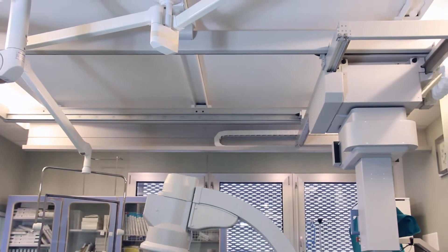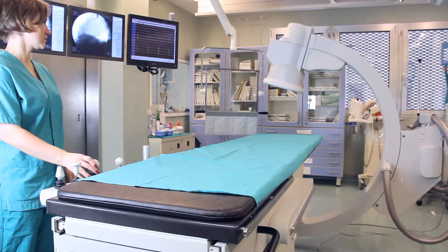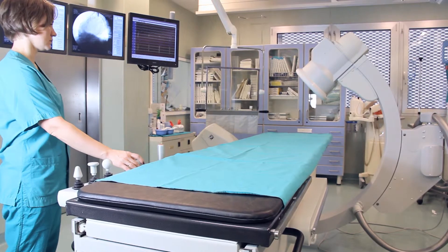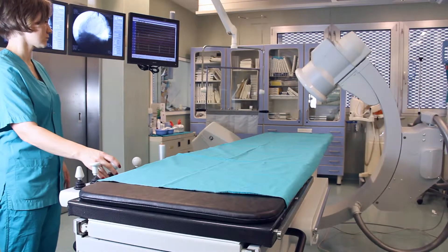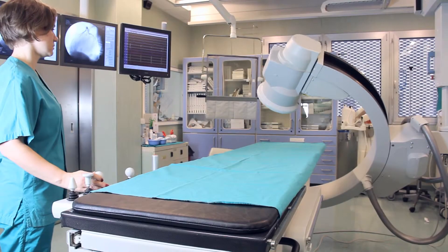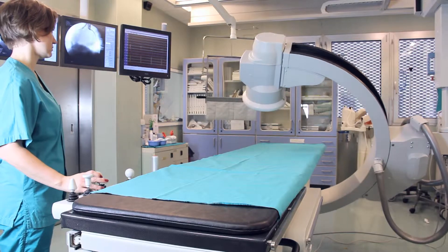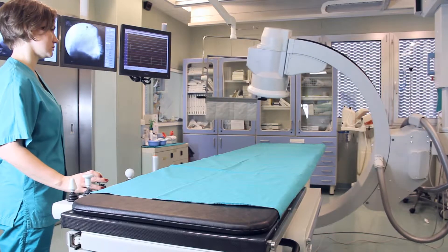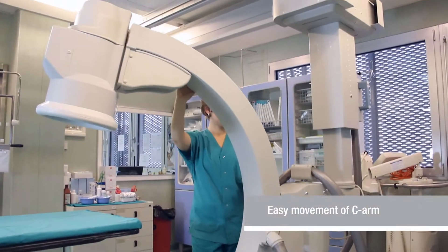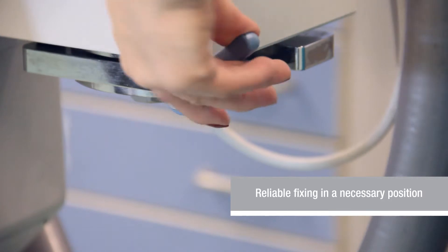The C-arm can easily be installed at any side of an operating table. The angiographic operating table ARIS table is irreplaceable. The moveable tabletop is controlled by a joystick, and the surgeon can move the C-arm to any transverse position. ARIS MR Cardio can also be moved manually — special locking handles will reliably fix the arch in the required position.